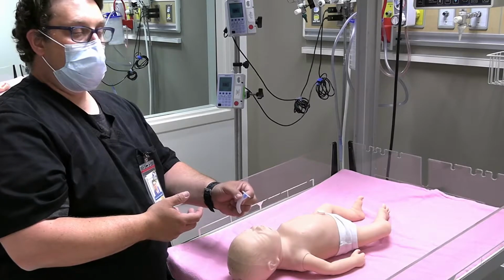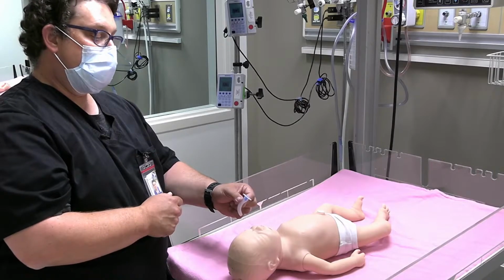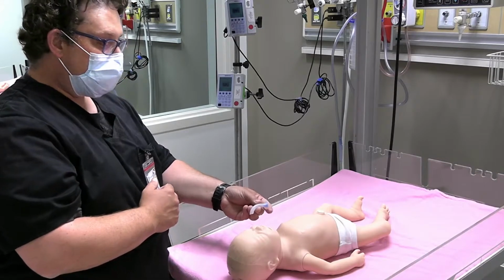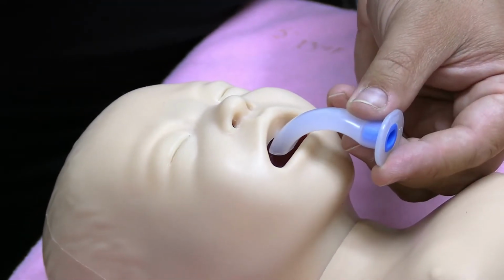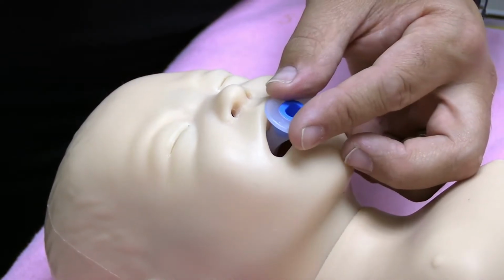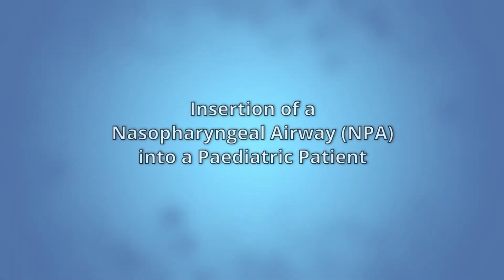Or with a piece of gauze and Magill forceps, you can have the forceps in the mouth to hold the tongue forward if you have difficulty passing the oropharyngeal airway in. So remember, with infants, it's going to be an anatomical insertion, just like so. In the mouth, follow the anatomical curvature of the tongue and place it in just like so.